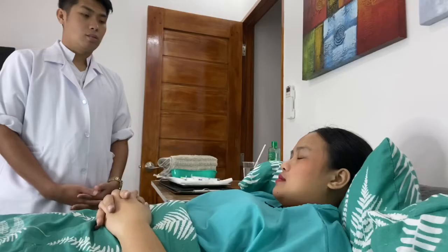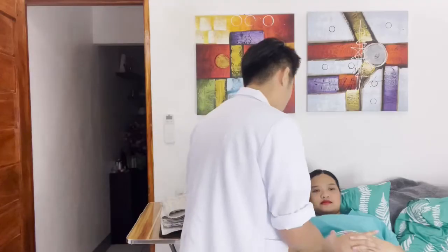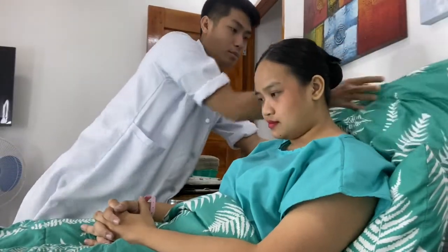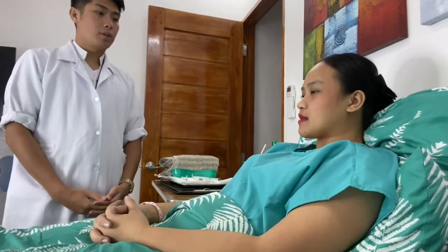Assist the client to a high Fowler's position if his or her health condition permits, and support the head on a pillow. Rationale: it is often easier to swallow in this position, and gravity helps the passage of the tube. Ma'am, I'm going to assist you to the upright position. Okay, ma'am? Ma'am, are you comfortable? Yes.